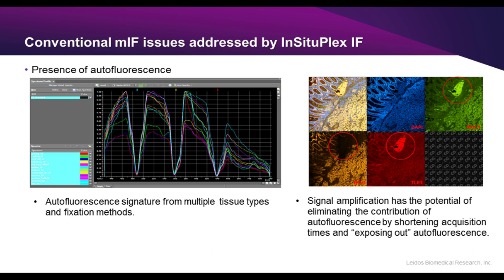It's kind of why we always very much suggest good wet lab procedures to generate the best quality section samples and images ultimately in the end for the data analysis. But the technology definitely enhances the artifact mitigation that we would see in a traditional conventional multiplex IF.